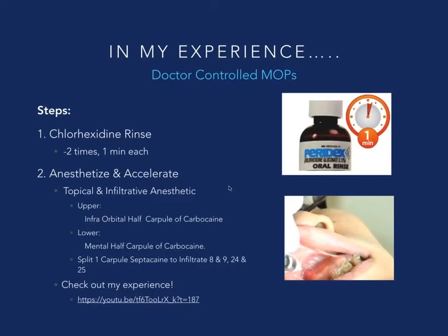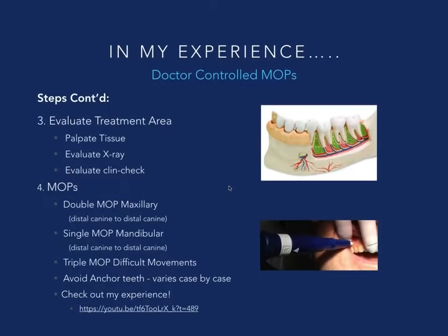All right. So we'll continue the mapping process here. In order to determine where we want to propel, I like to palpate the area, look at some x-rays, and make certain I know where those roots are going, so that I'm obviously going to try to dodge those as I propel. The other decision you're going to want to make is which areas to propel, and that gets into where exactly I'm going to dimple the tissue.